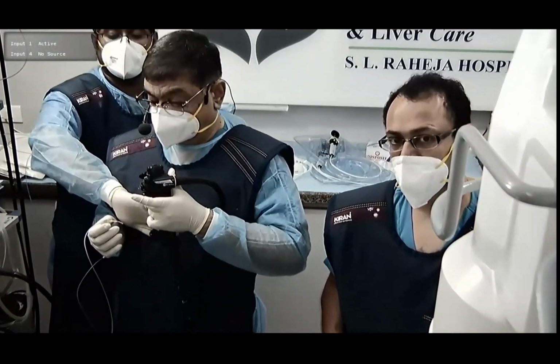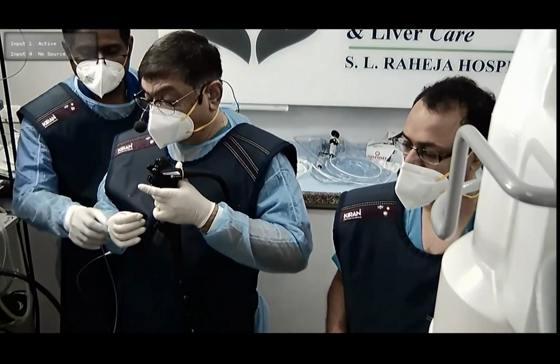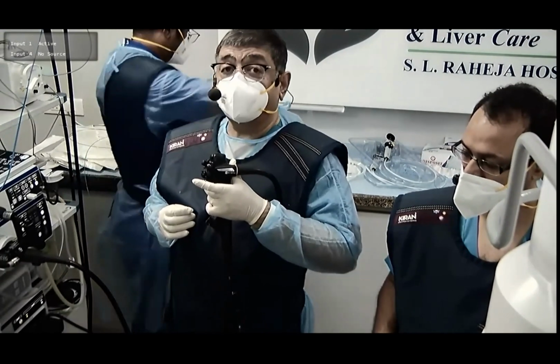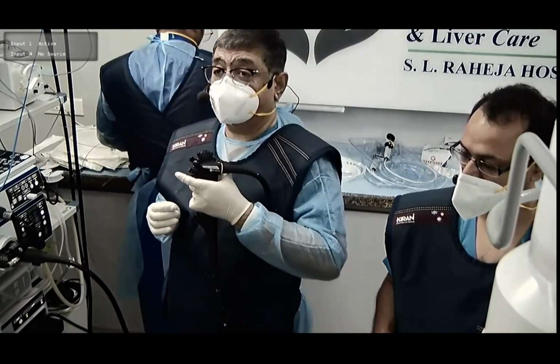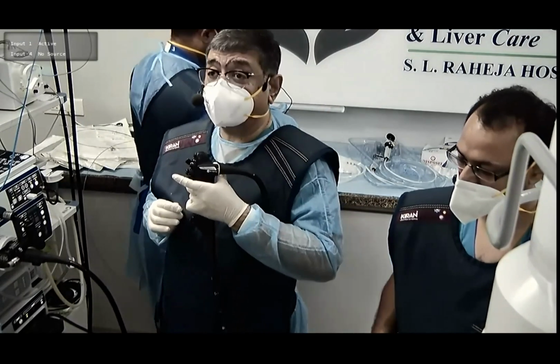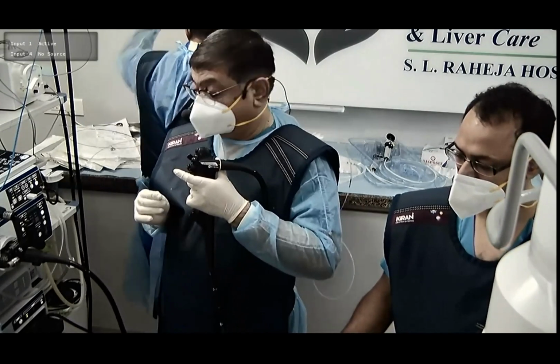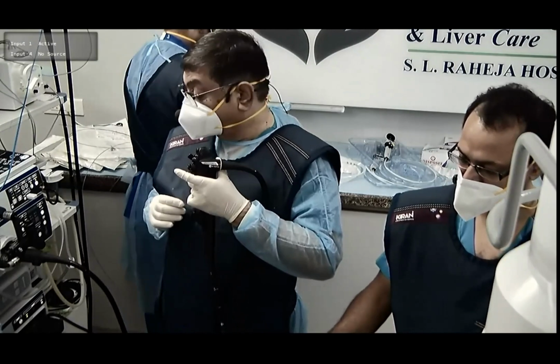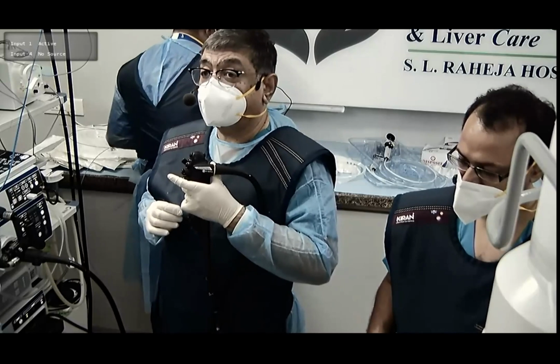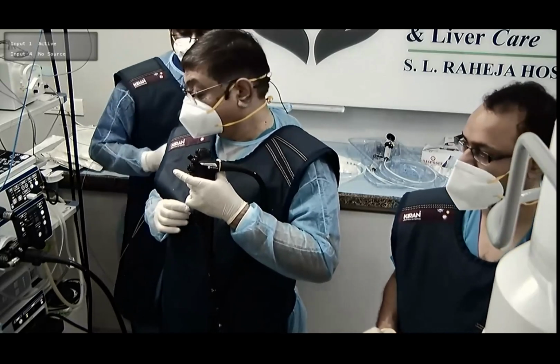Once we hold this wire, hold it tight, open the snare, and now we can put a sphincterotome over it. I will withdraw a little more. Is there enough wire? So I am withdrawing this wire. See this? So that a sphincterotome can pass over it, and then you can complete your ERCP. This should be enough, I think.